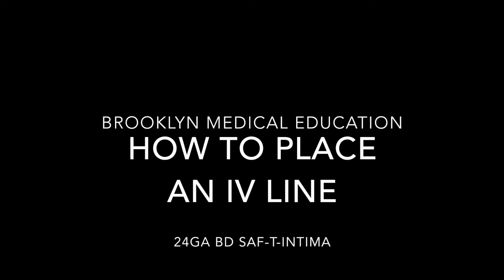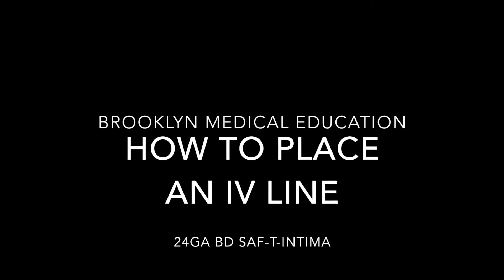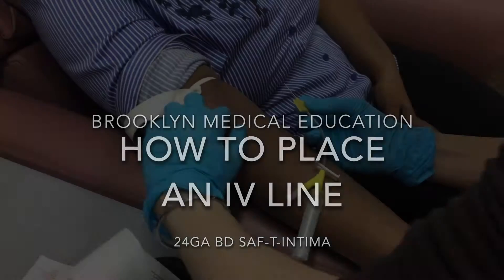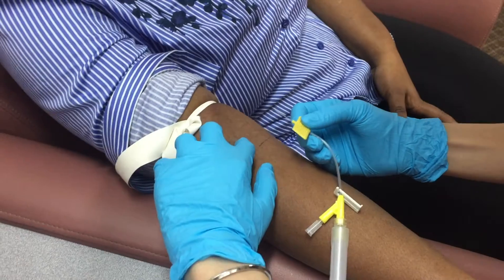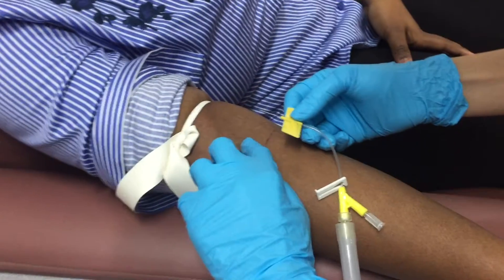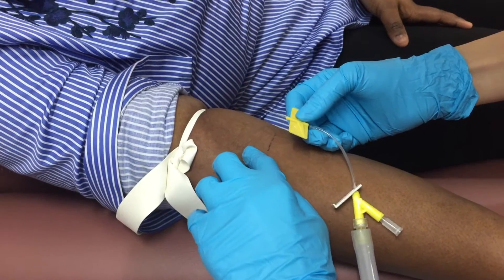Hey everyone! Today I'd like to show you how to place an IV line using the BD SAF-T Intima 24 gauge needle system. After tourniquet placement and thoroughly cleaning your insertion site with alcohol, you are now ready for the venipuncture process.